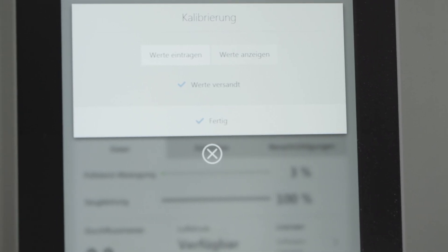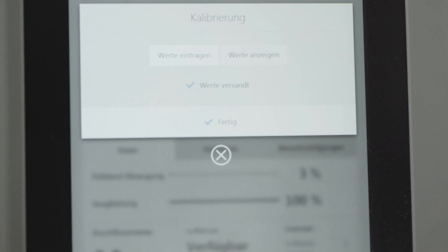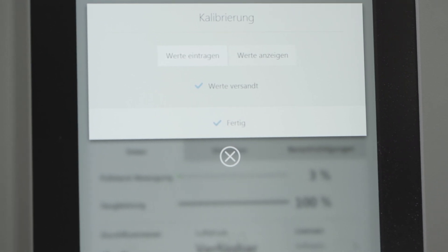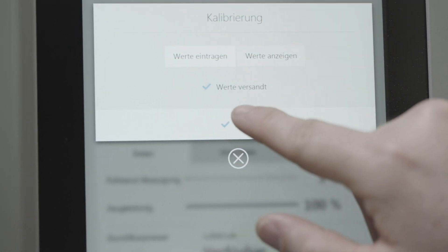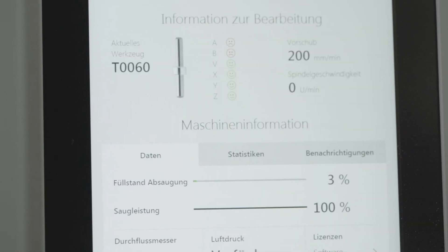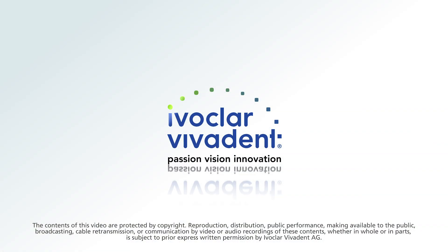Once you have entered all values, tap on Confirm. Your machine is now calibrated.